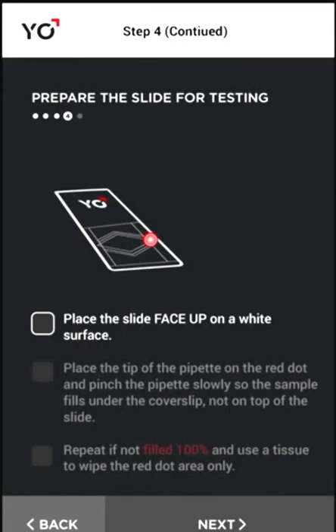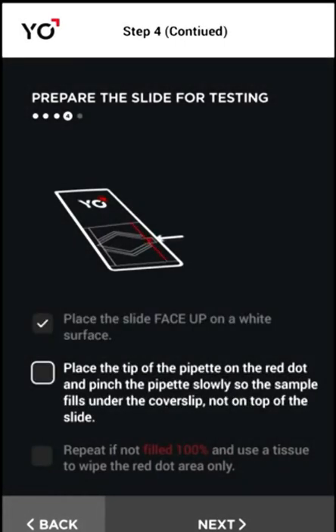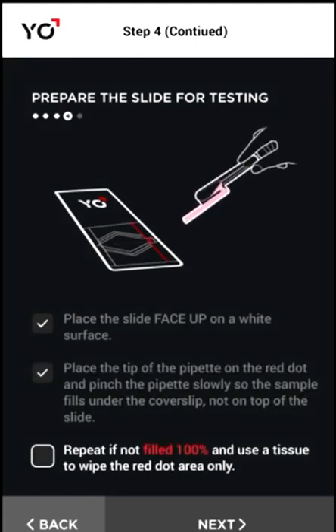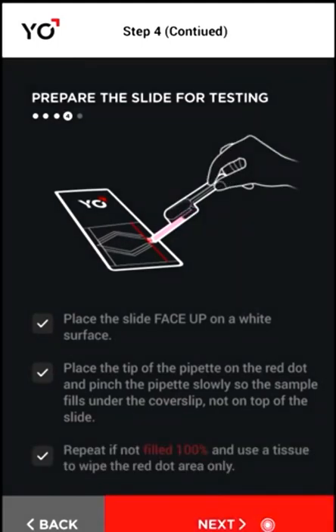You now need to fill the YO slide with your sample. Find the red dot on the slide and put the tip of the pipette on it. Pinch the pipette slowly and watch as your sample fills the slide's triangular well.